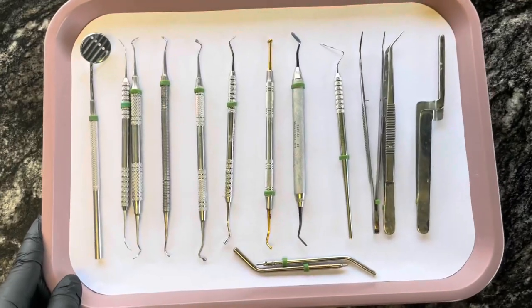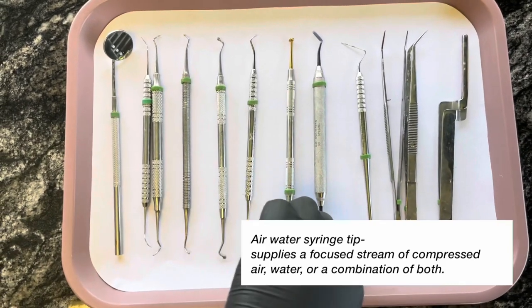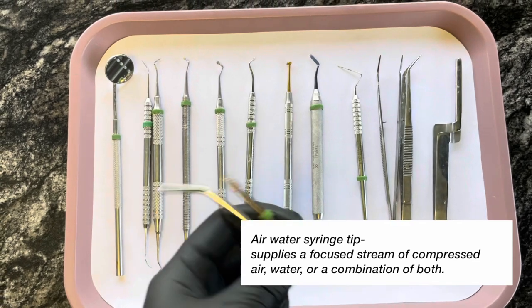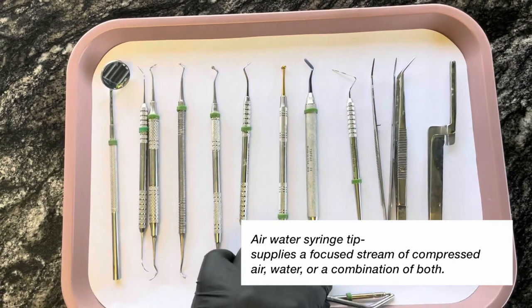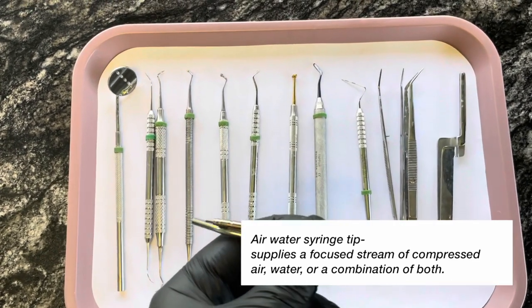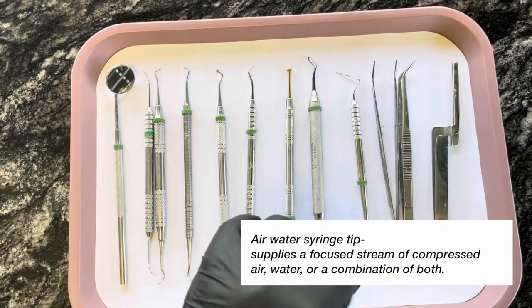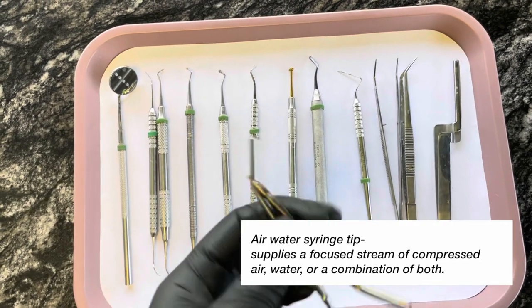So the last two things are air water tips — one is for the doctor's side, one is for the assistant's side. These are used to attach to the air water syringe and they just squirt out air or water.